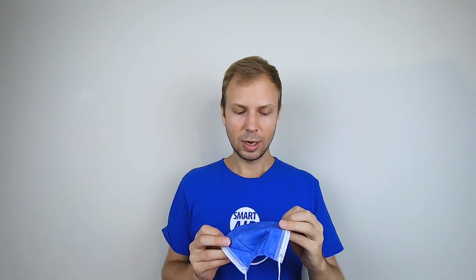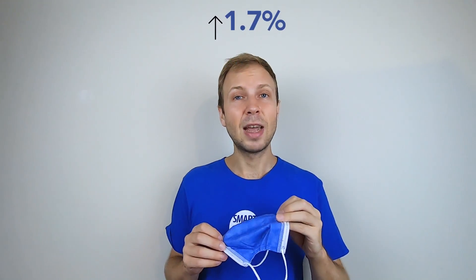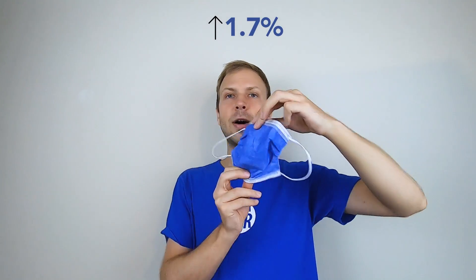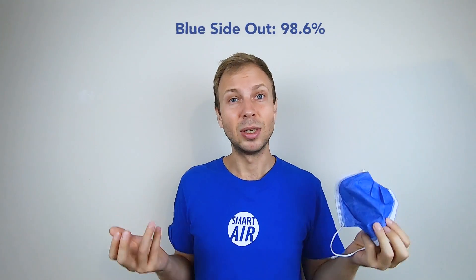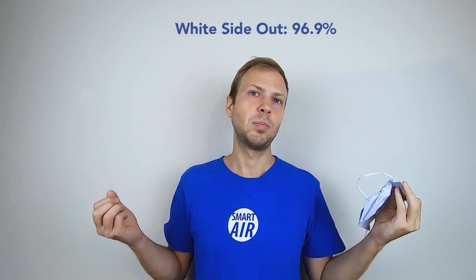The difference is not that big, so if you've been wearing it the wrong way around it's not too much to worry about. We found that there was a difference on average of 1.7% between wearing it the right way around and wearing it the wrong way around — with the right way around filtering on average 98.6% of the particles and the wrong way around filtering 96.9%. Hope that information was useful and remember to breathe safe and stay safe.